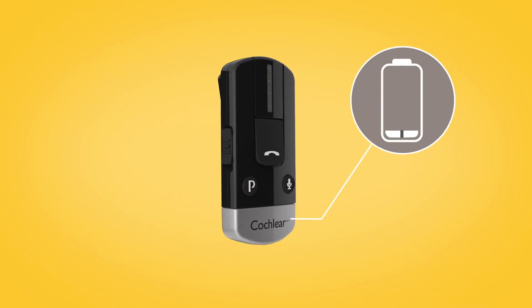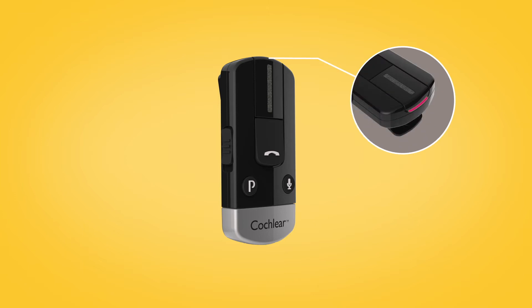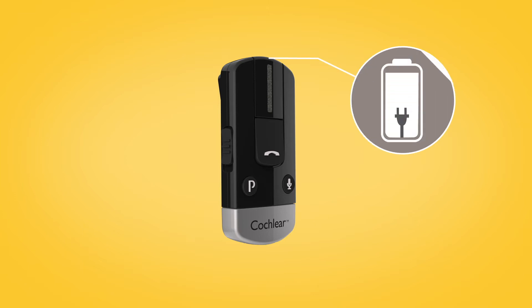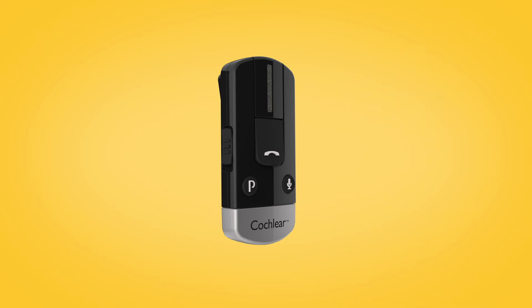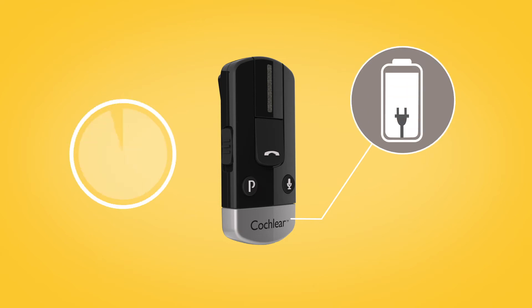While charging, the LED on top of the phone clip lights red. When fully charged, it lights green, with red flashes every two seconds. Before using your phone clip for the first time, make sure it has been charged for at least three hours, even if the light indicates a full charge.